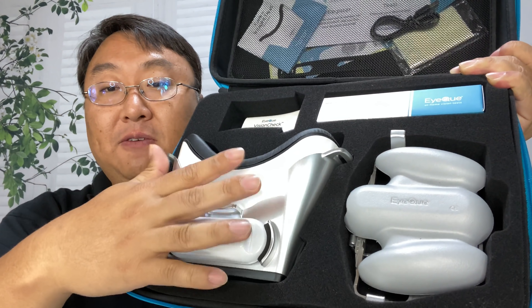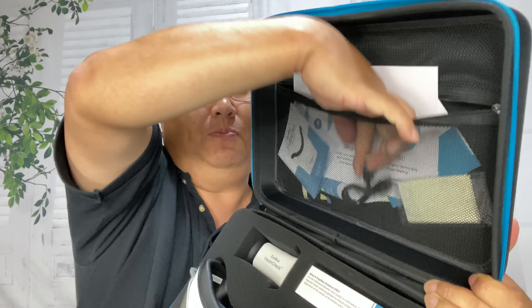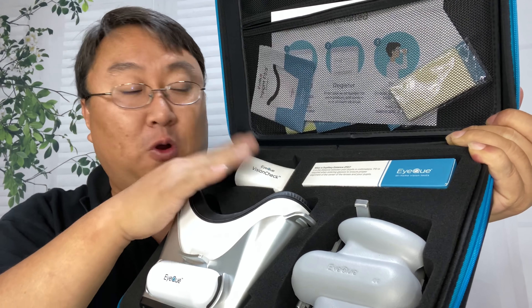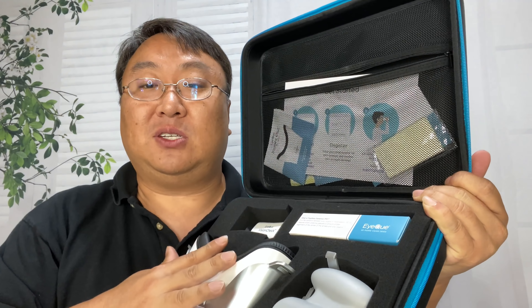Up here we get some of the straps that you might need — this one is for the vision test piece. It also comes with a micro USB cable and a rubber strap to hold this little device onto your phone, which I'm going to show you in a minute.